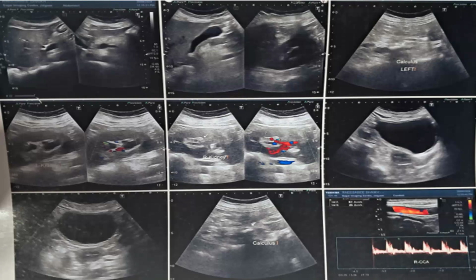See, it is shown. It is probably a ureteric calculus. Just see the upper row, the last. Ureter also dilated, sir. Proximal ureter.